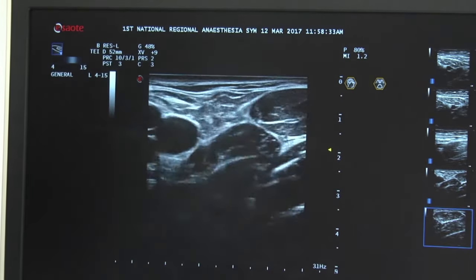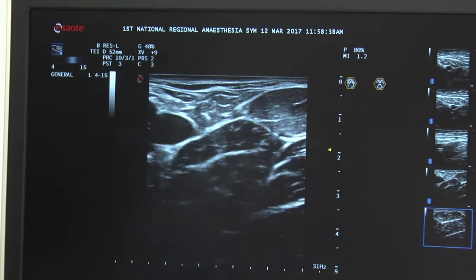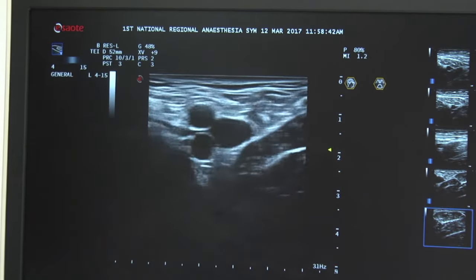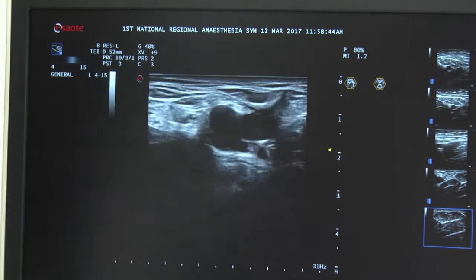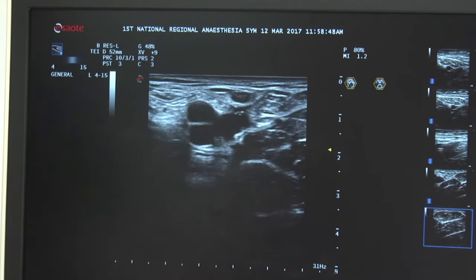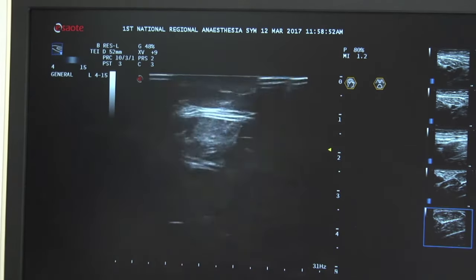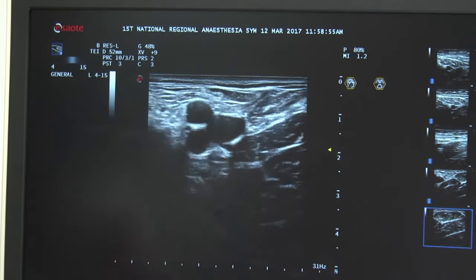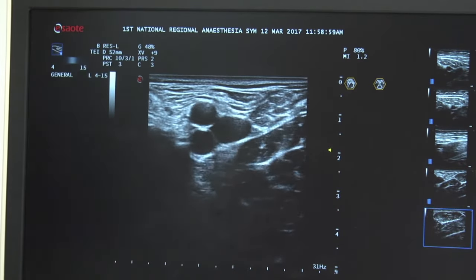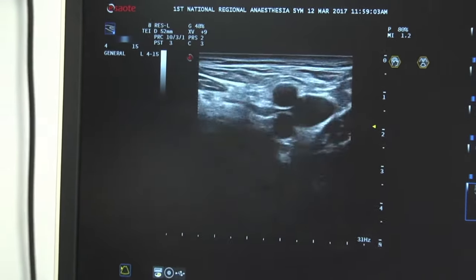And this obturator nerve together with the femoral nerve and lateral cutaneous nerve combination, can it provide anesthesia? It depends on the case, but if I want to provide anesthesia only by peripheral nerve block, I combine femoral, obturator, and lateral cutaneous nerve block, and sciatic. For hip.